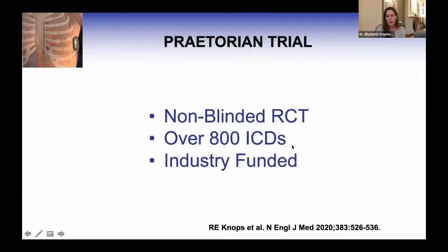So we have great new evidence, which is really helpful. The Praetorian trial was just released a few months ago, and this was quite a large non-blinded RCT, looking at just over 400 sub-Q and just over 400 transvenous ICDs. It is industry funded and was published in New England Journal.